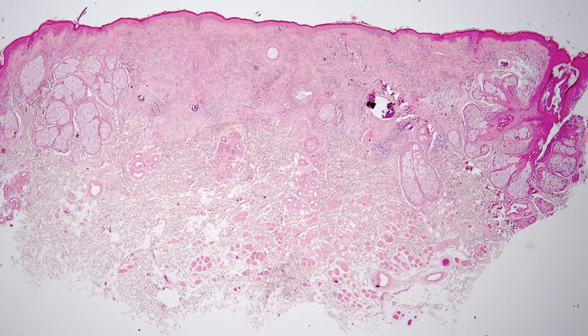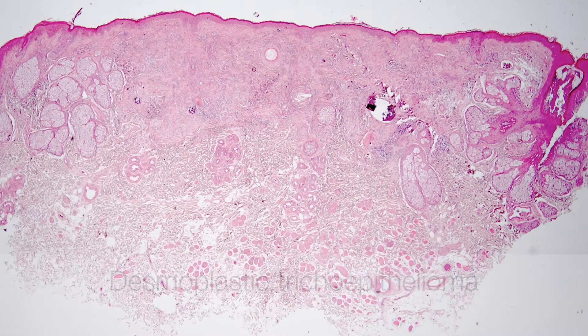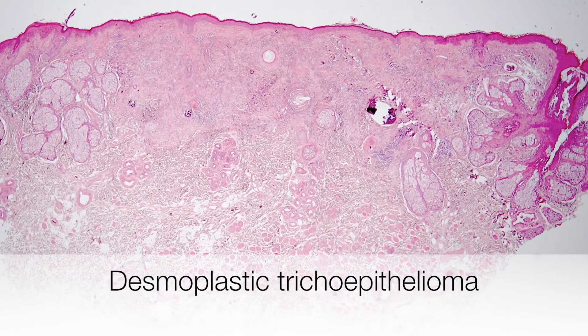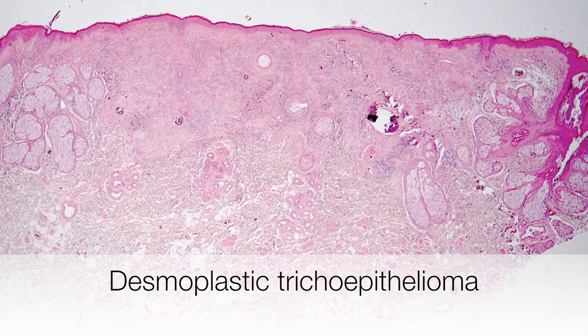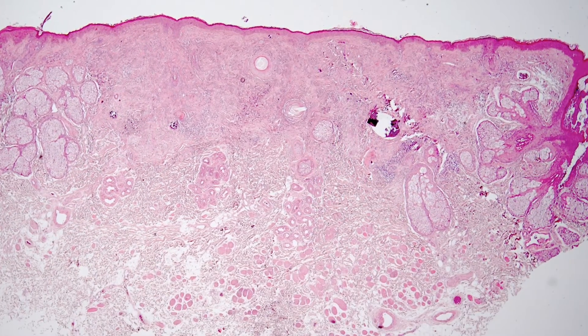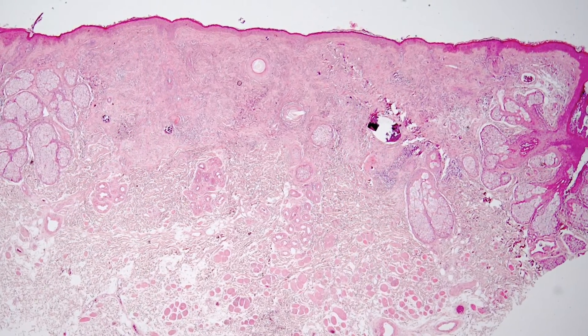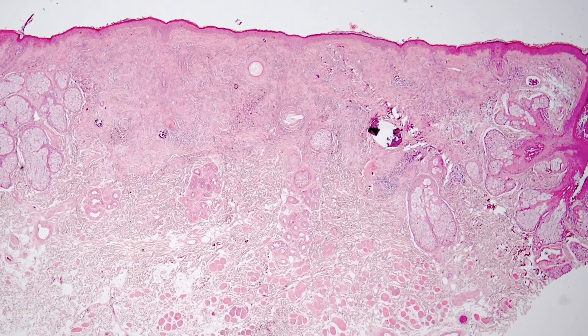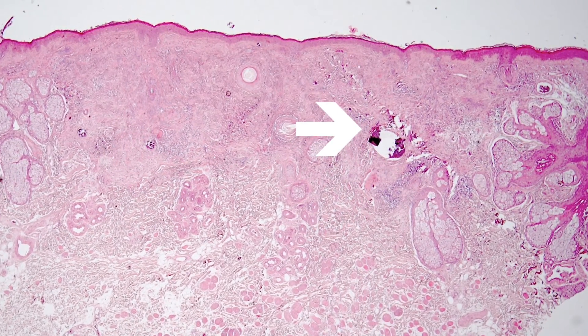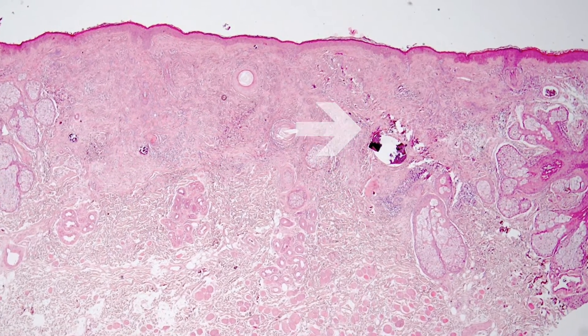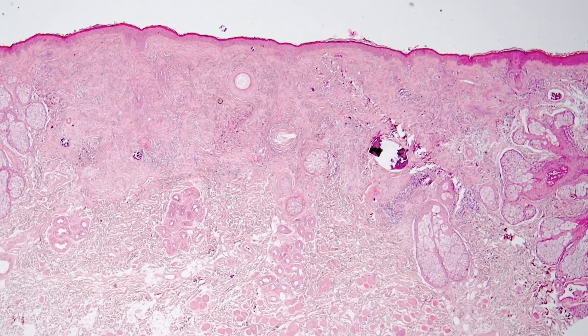This is a very low-power view of a desmoplastic trichoepithelioma. At the top right of the picture is a purple area. This is a calcified horn cyst.